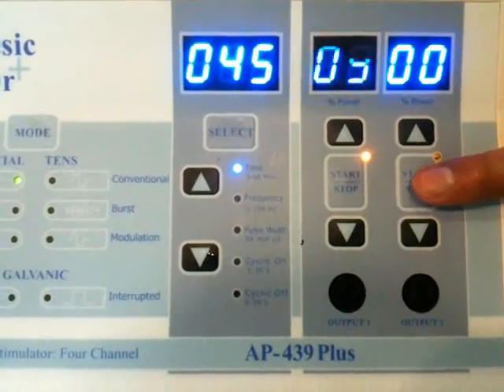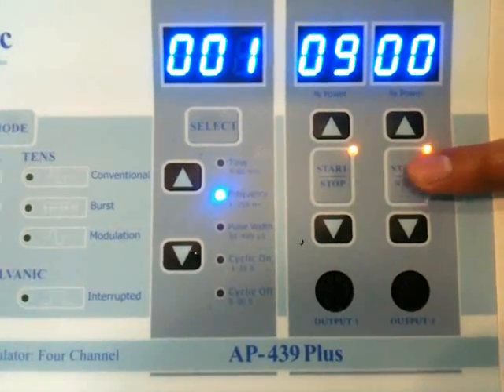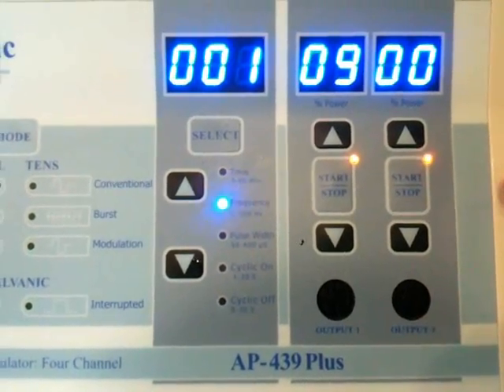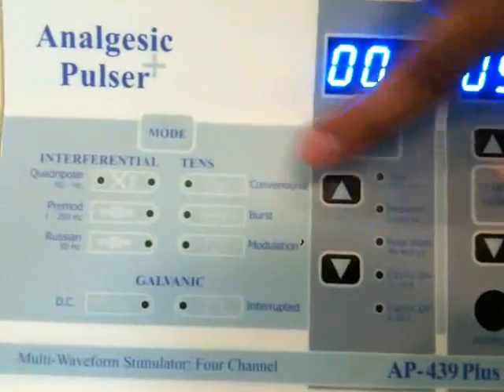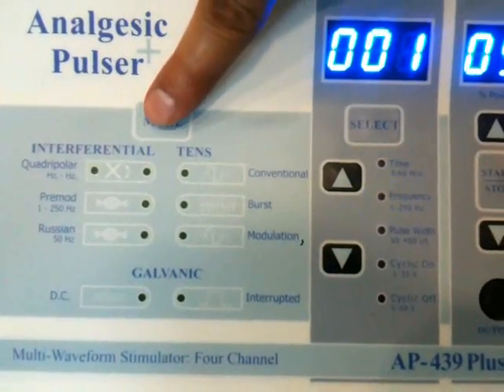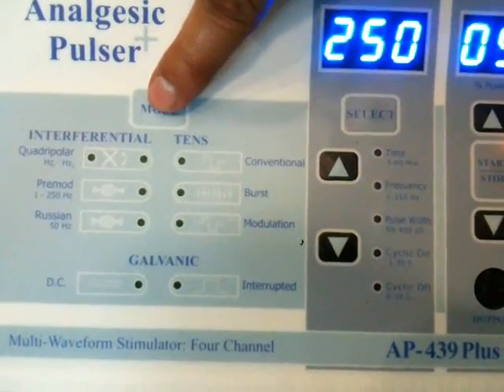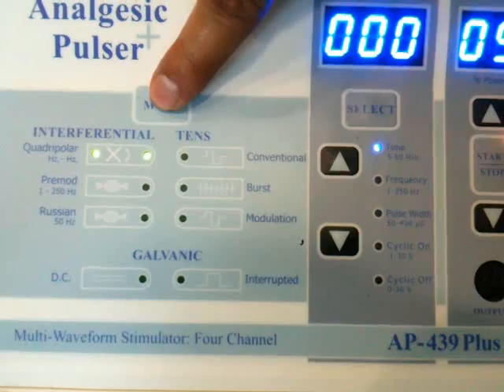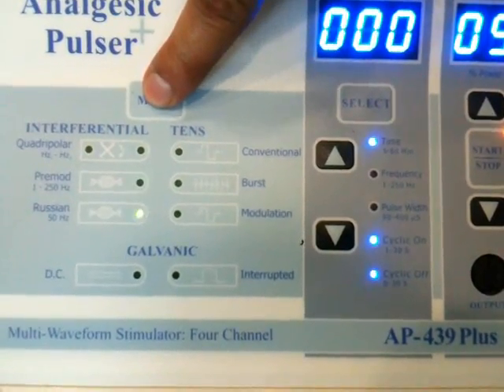Now activating channel 2. By default it's selecting Interferential. Now changing the mode to Galvanic by pressing the mode key.